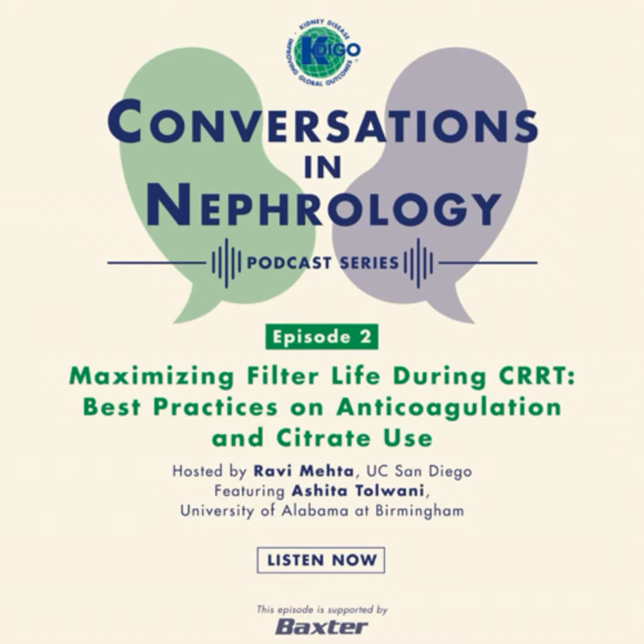issue. The other thing to be aware of is the potential complications of RCA. These include hypernatremia, depending on the citrate solution you use. Since citrate chelates calcium, you can have hypo or hypercalcemia. Citrate also chelates magnesium, so you can have hypomagnesemia. And of course, since citrate is converted to bicarb when the liver is working, there are acid-base disorders you have to be aware of.